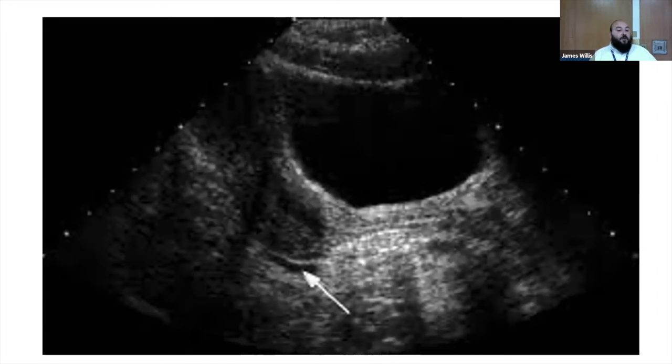In the suprapubic view, you see the image above. What do you do next? How do you interpret this image? You know, we always hear about physiologic free fluid in young women. So we know that it's common to find physiologic free fluid in women of childbearing age. There's varying amounts of free fluid depending on where in their menstrual cycle it is.